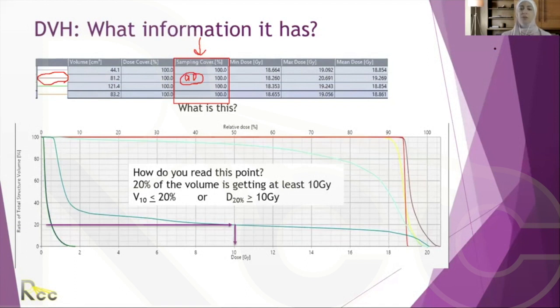يعني كل شيء رسمه الطبيب أو الطبيبة طبعاً, كل شيء رسمه الـ radiation oncologist, have to be included in this grid.